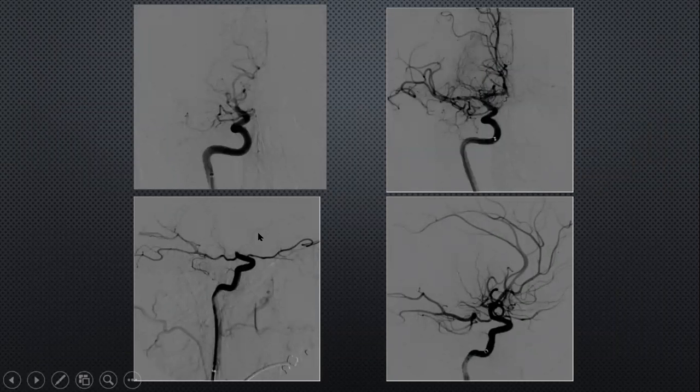Just to show you this patient with a stroke over here, you can see the carotid within the neck. And just to show you the anatomy again, this is the lateral view, with the cervical carotid artery, the petrous portion over here, then the cavernous, and the clinoid portion is going to be here. This is the ophthalmic artery, the PCOM artery. The choroidal we barely see. We see some perforators coming from the PCOM, and then the stump, where the occlusion has occurred in the part of the artery between the PCOM and the carotid T.